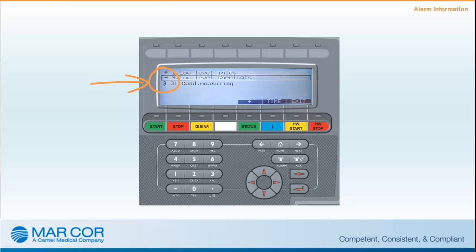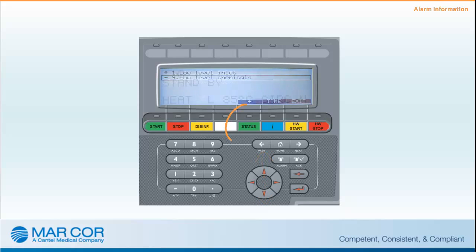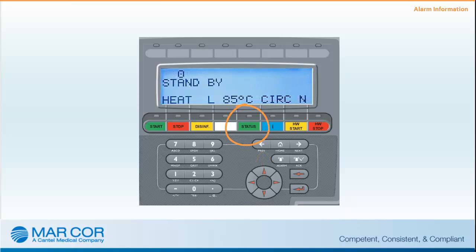In some cases, consecutive alarms may occur; it's important to acknowledge all alarms. Use the arrow buttons to find all alarms and take action. When the fault has been restored, press the Status button to return to the normal display. For a complete alarm list and troubleshooting guide, refer to the service manual.